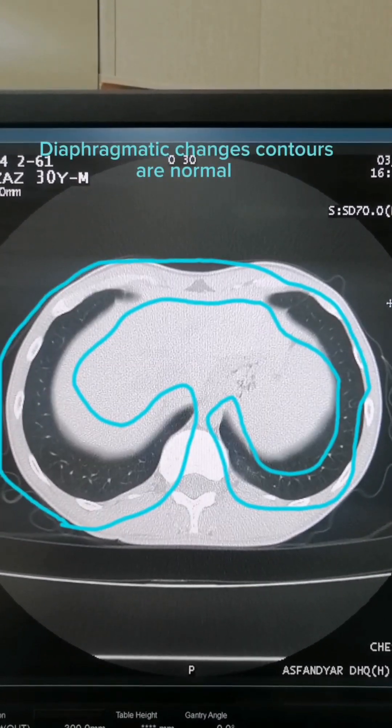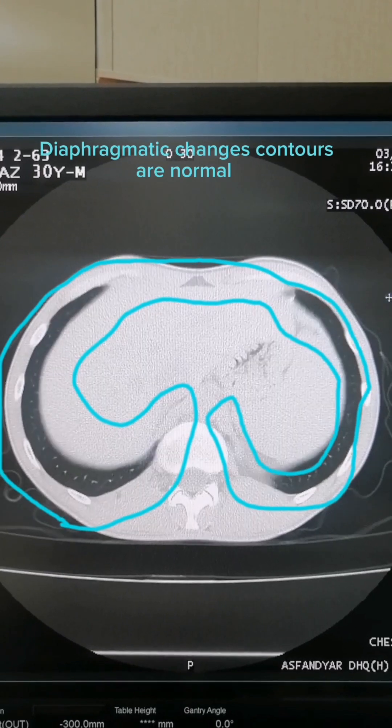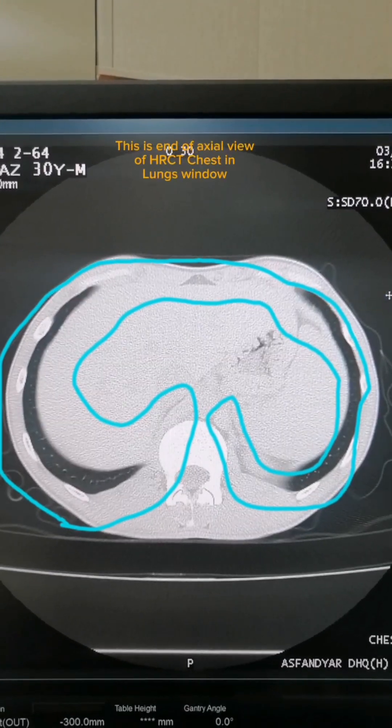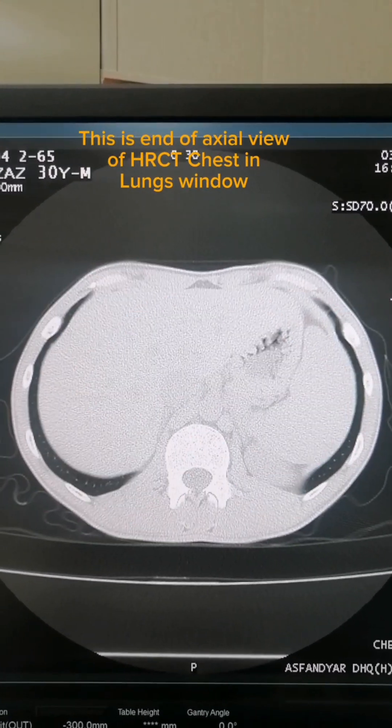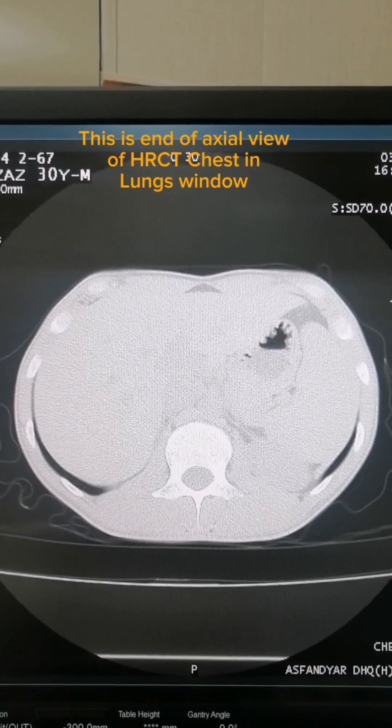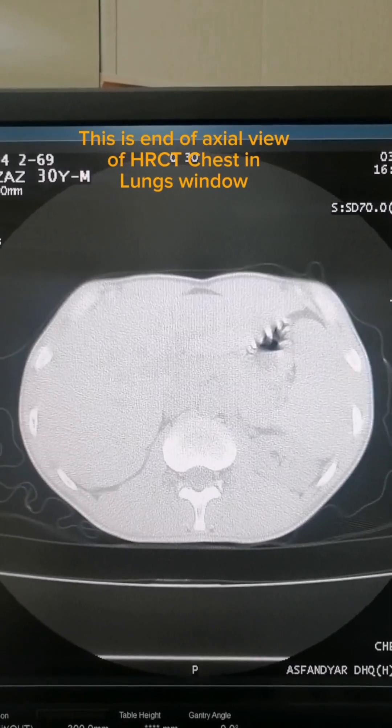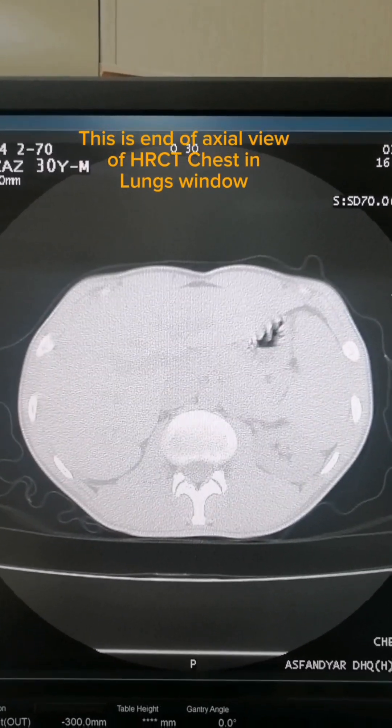Diaphragmatic contours are normal. This is the end of the axial view of a CT chest in lungs window.